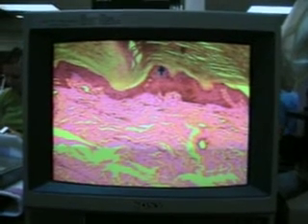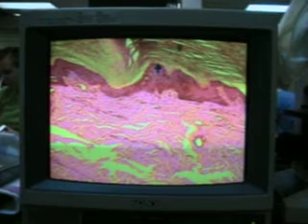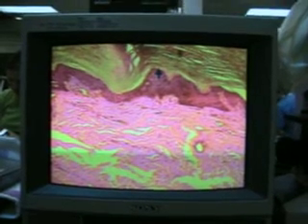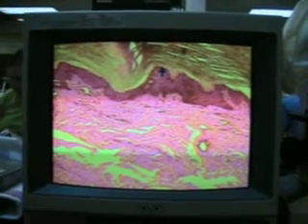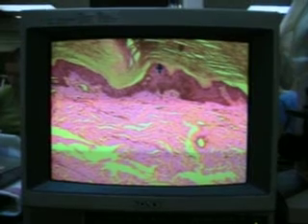And sometimes in certain sections, the stratum corneum has a lighter area just above the stratum granulosum, and that has a special name to it, which is the stratum lucidum. And I have yet to see a good example of that, but that's basically the enucleation and the immature husk, which isn't as dense perhaps and filled up with other components, so it's a little bit lighter.